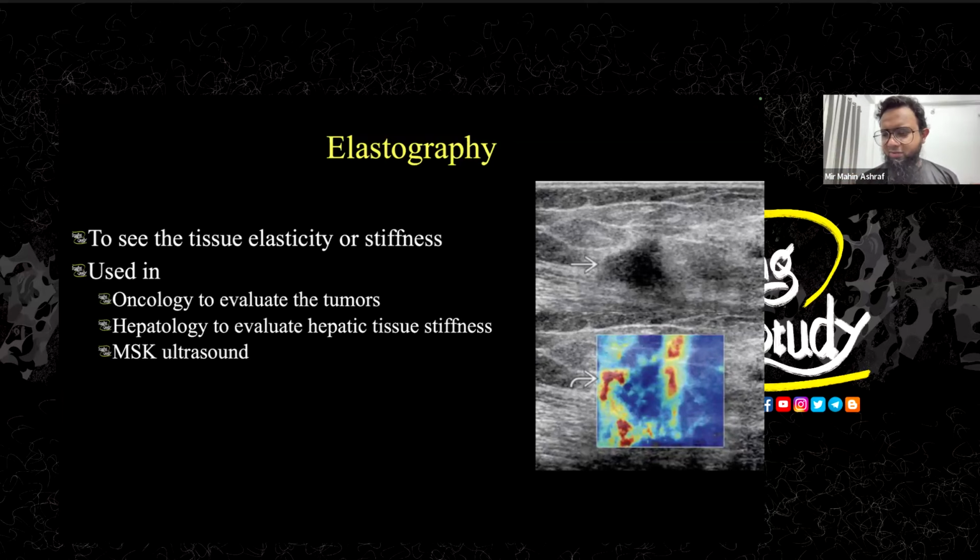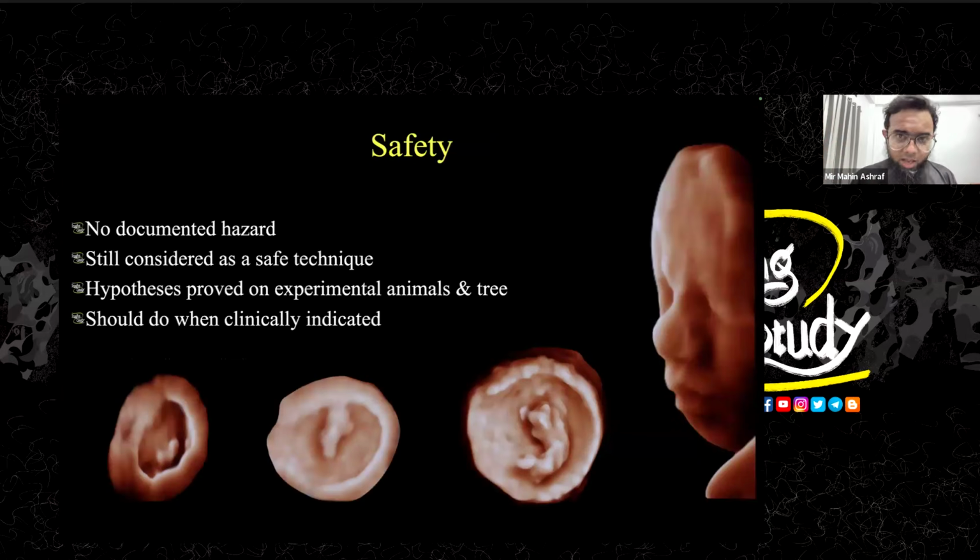So I'm not very happy, or maybe I'm not very expert on elastography because it's an operator dependent technique and sometimes it gives a false result. But I use it in some suspected cases, obviously. So make sure you know the limitations of elastography, which needs a very big lecture to solve.